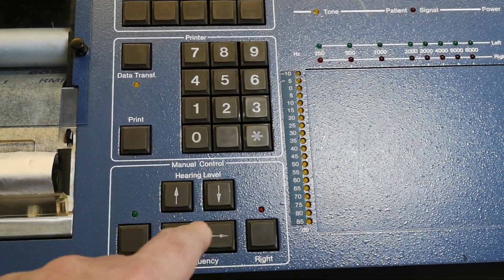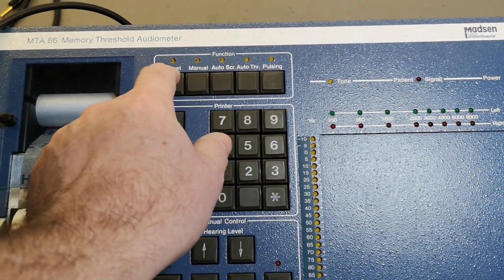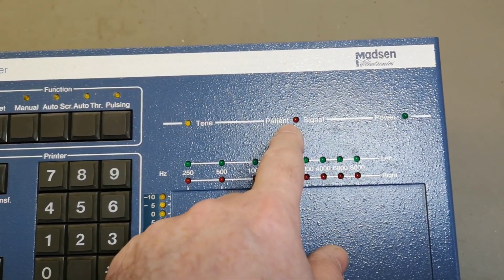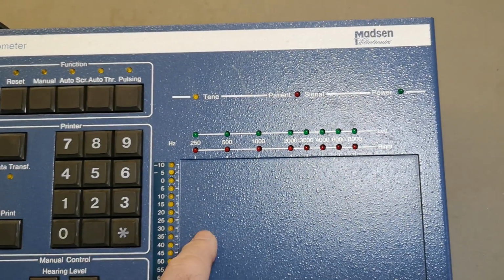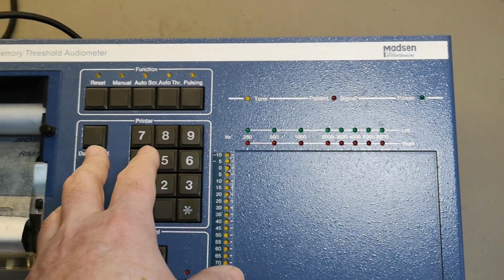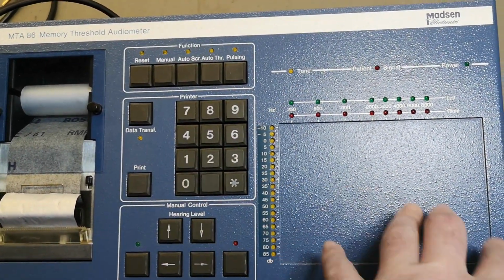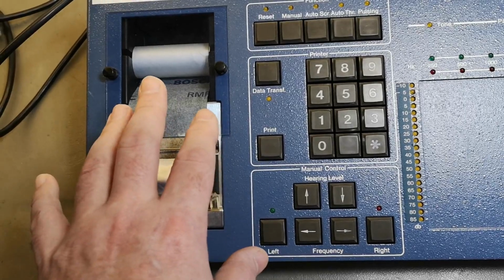So the person got some headphones on, and then you manipulate this in manual mode, or you can run some auto functions, and then the test person pushes the patient. It's actually called a patient. So there's a patient signal that the patient pushes every time he hears this tone at this and this level, and then the test is repeated with a lower and lower level, right? So I think this is why this is called memory. It remembers the lowest signal per frequency in left and right, and then when you're done, you can print out a report or some signals or whatever. I don't know yet how that is going to look.